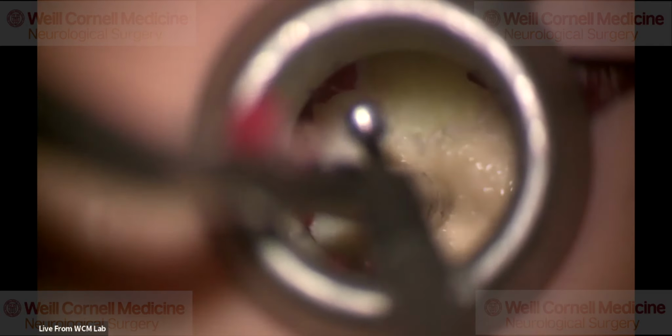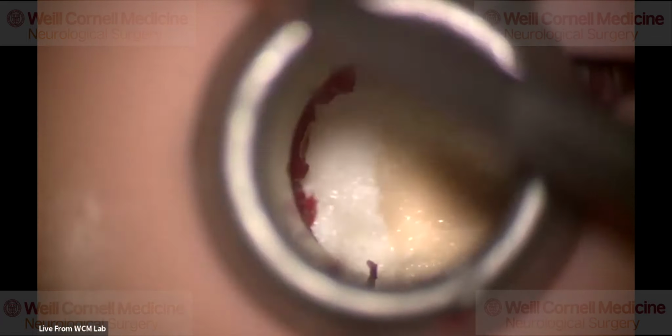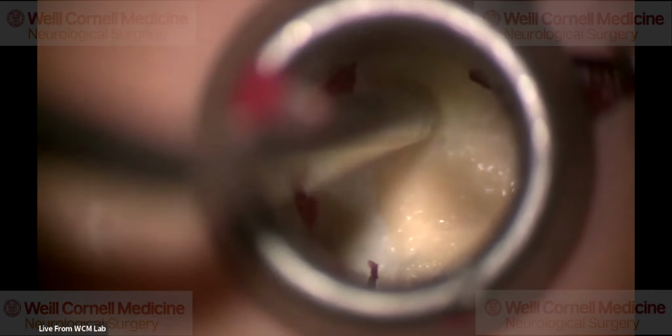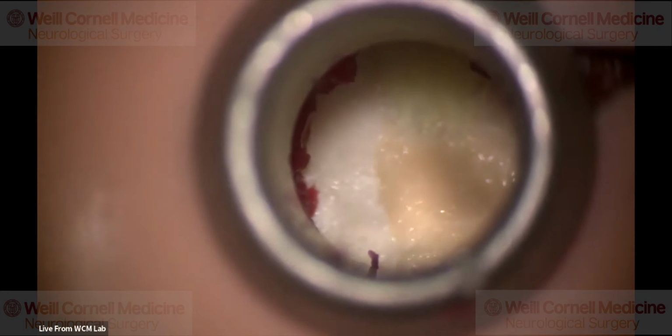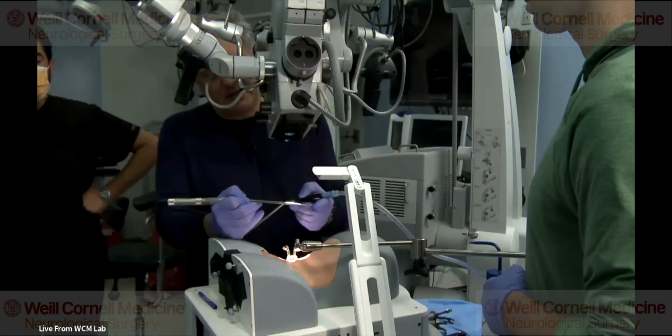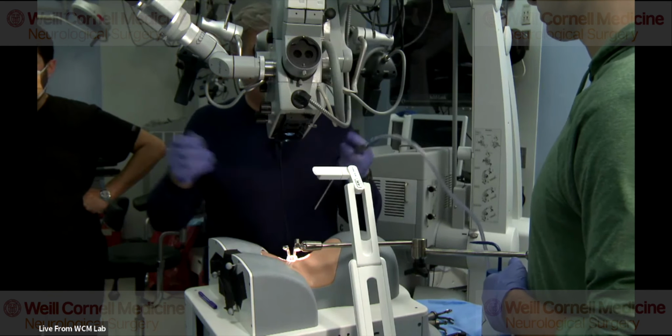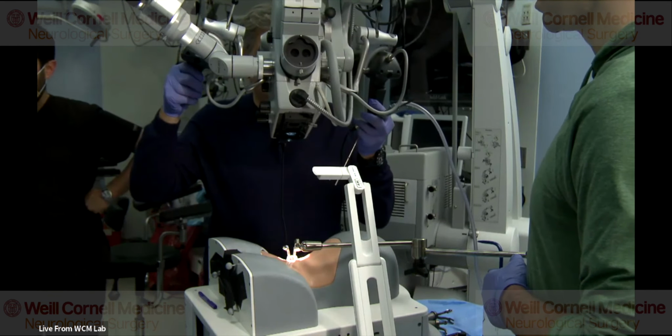So here, and then I'll start drilling. Again, the thing is I use a curved drill. I use a matchstick for foraminotomy. Sometimes when I do an MIS laminectomy in the cervical spine, I use a diamond burr. But either way, I think it's fine.